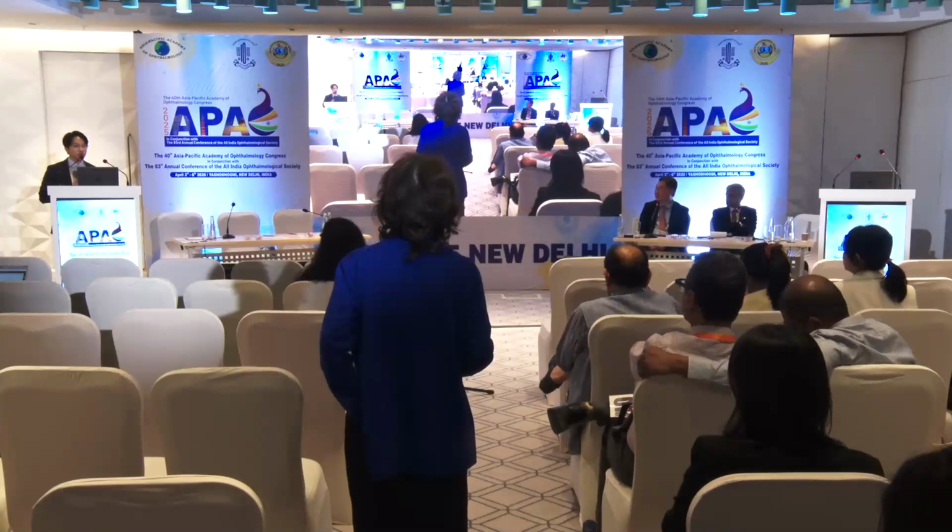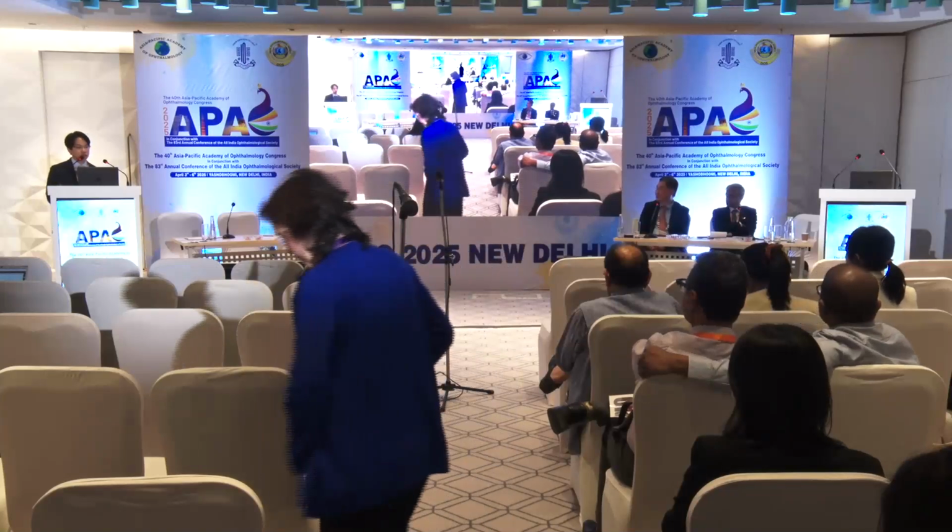Yes, thank you for the comment. I think so too, but for the myopic traction maculopathy cases, we should peel the ILM across the retinal vessel to resolve the tractional forces. And in some cases, like the dome OCT cases I just showed you, the vitreous traction to the retinal vessel is very hard.